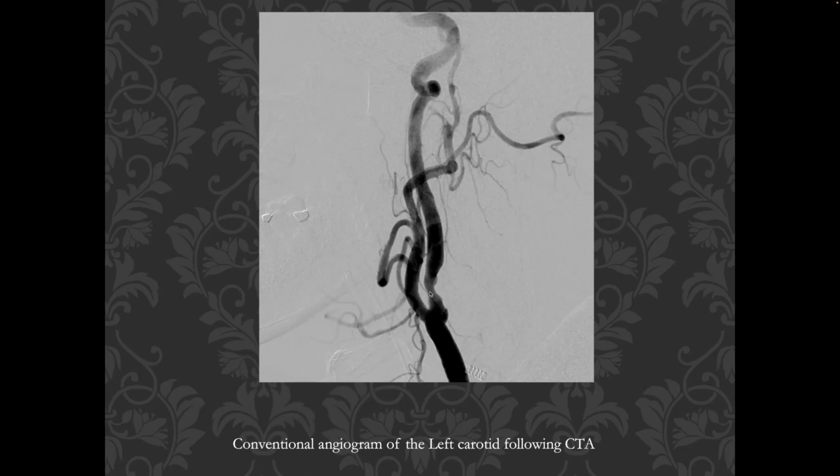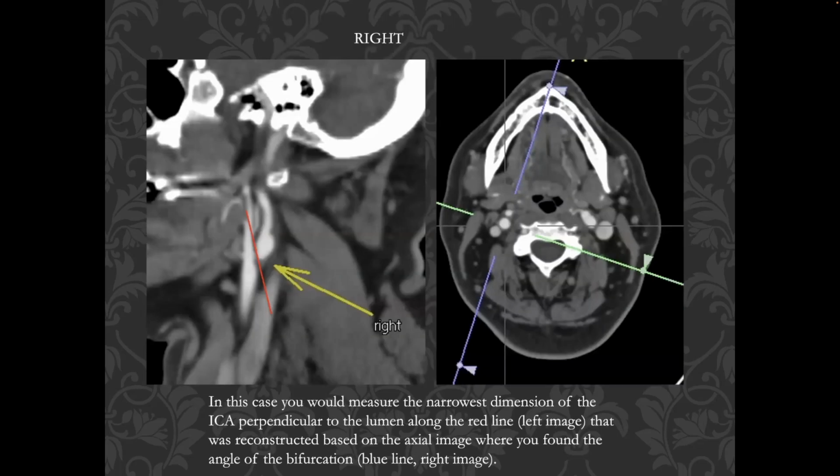Now, the reason that was done as a percentage, of course, is that in those days, with conventional angiography, or now digital subtraction angiography, there is a magnification effect. So we didn't actually have absolute values. So it was done as a ratio, which is clever and broadly applicable. But with CTA, of course, we now have ways of measuring in increments that are reliable.